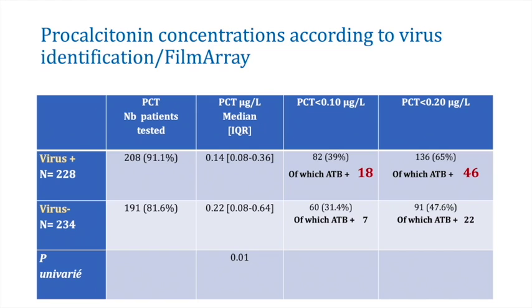As you know, to help the physician make the difference between a bacterial and a viral infection, we also have biomarkers. And we have used Procalcitonin measurement for 2 decades to help ED physicians make the differentiation. So we looked at the combination of PCT and PCR by FilmArray in identifying viral infection.